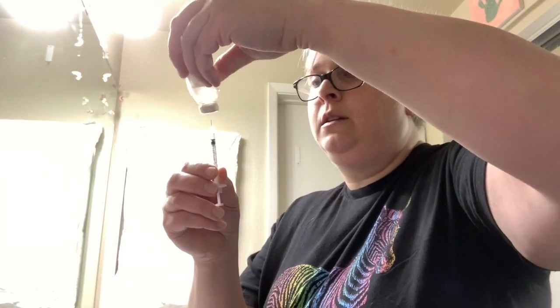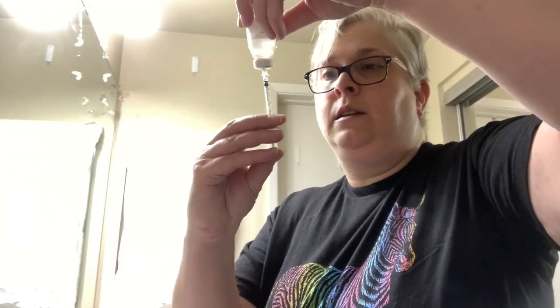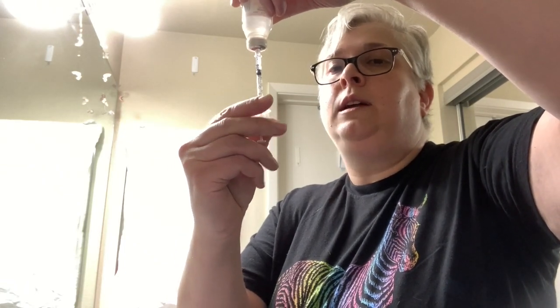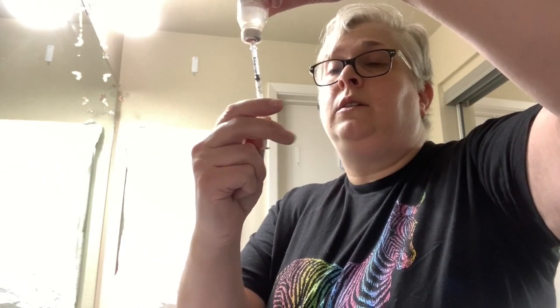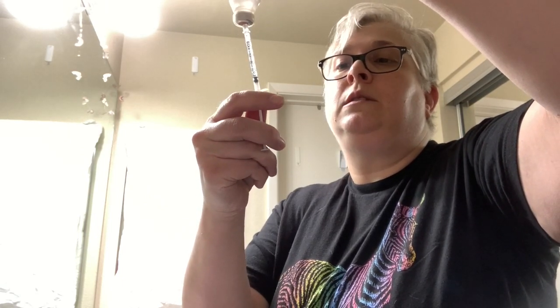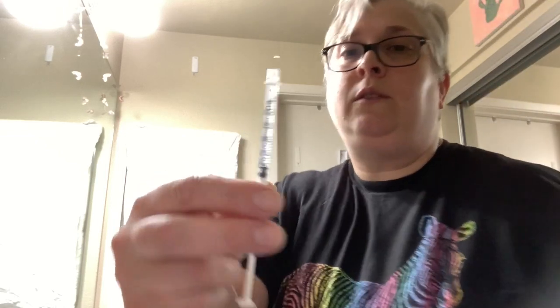Now, with the vial upside down and some air in the syringe, stick it in, push the air in, and I'm going to draw out — in this case I'm going to draw out the full syringe, 30 units. And I don't have any bubbles — it's pretty good.